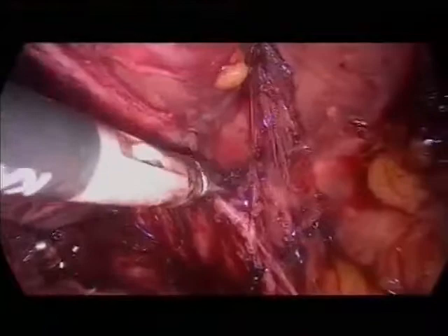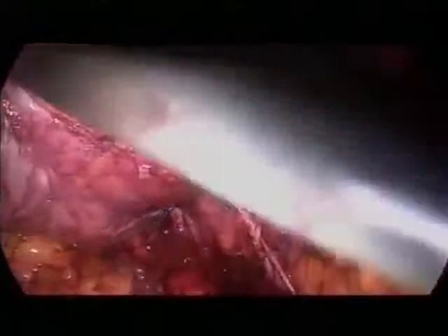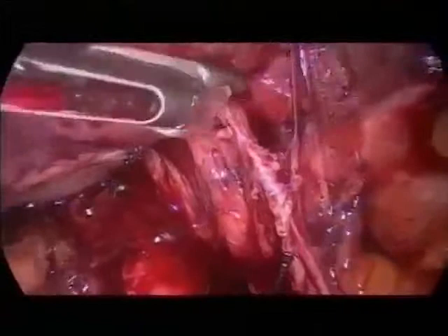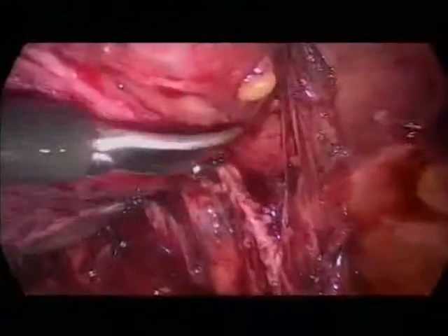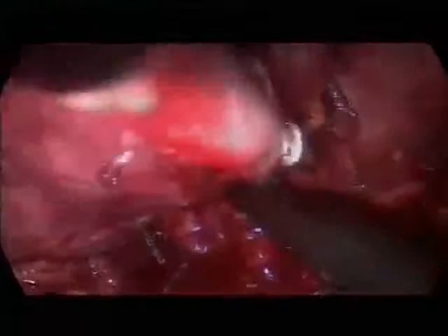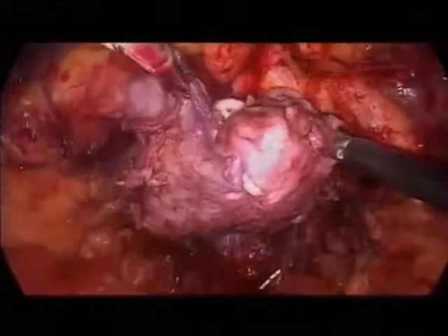I can't push. It's totally fixed here. For this reason, I will clip this. There's no way to push down, so give me a clip. I have a clip here. Okay, good. Oh, it's fixed here. Okay, go back, midline. So, now it's nearly completely mobilized.